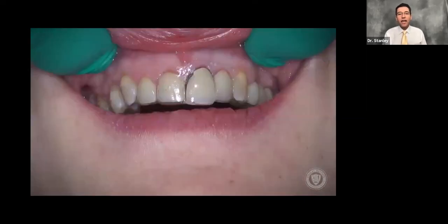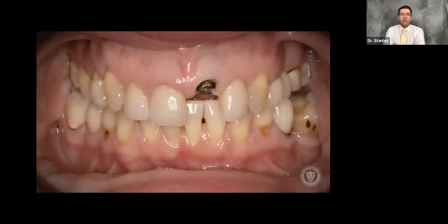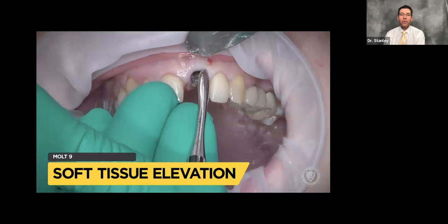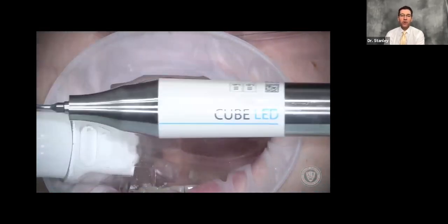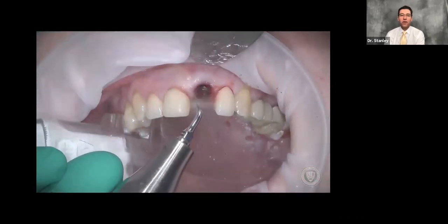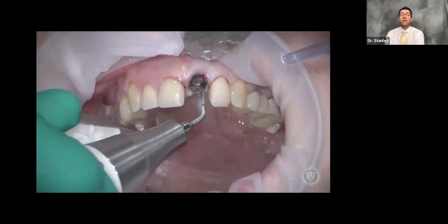Let's run the video one more time. Extraction of tooth number nine, immediate implant placement, and gap grafting. We have the broken tooth. Radiographically we plan it, ensuring that the five thread rule tells us we have a high probability of taking the root tip out and getting the implant in one procedure. We use the Action Cube piezotome to help remove the tooth without trauma to the surrounding tissues — using it on the mesial, the lingual, and the distal, but never on the facial.